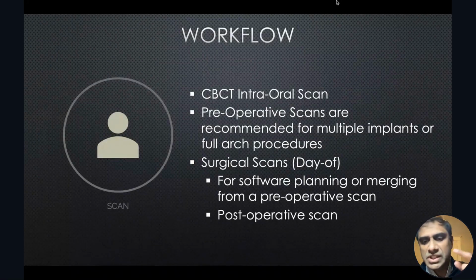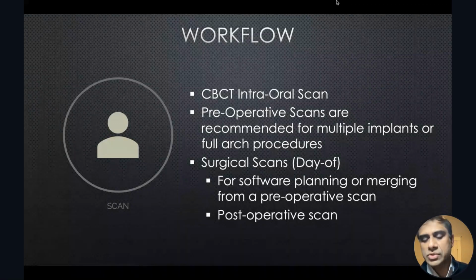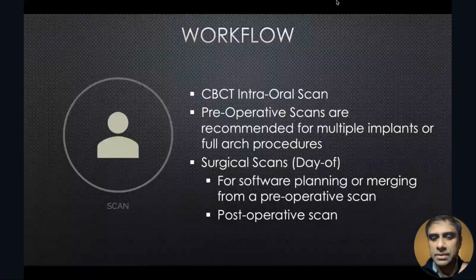Now, sometimes if it's just a single implant, I don't even take a preoperative CBCT. I just go on the day of surgery, take a quick CBCT, and then it literally takes me anywhere from 5 to 10 minutes to plan placing the implant. But if I have more than two implants or multiple cases or full arches, then I prefer to get a preoperative scan, where I can plan all the cases. Then on the day of surgery, I take another CBCT with a splint on there, I merge them together, and then I go into surgery. Pretty seamless. Next slide, please.